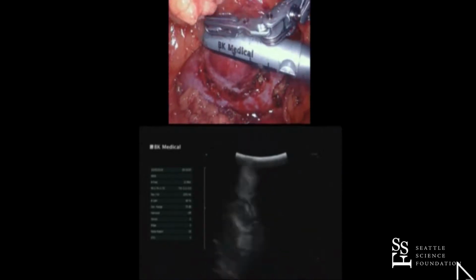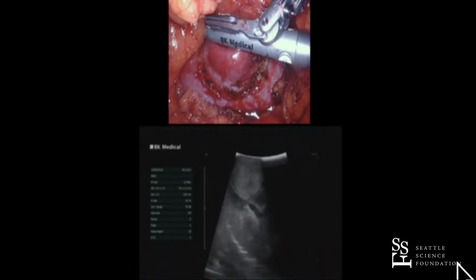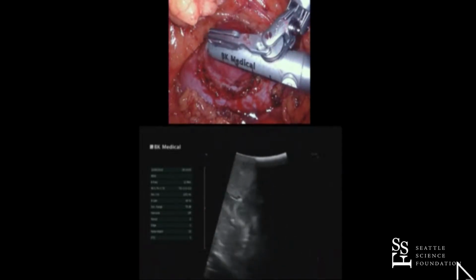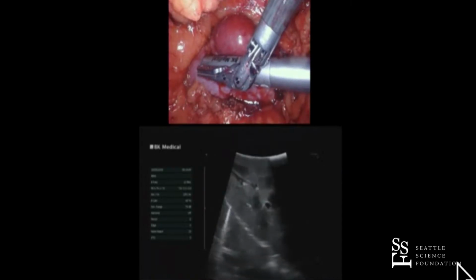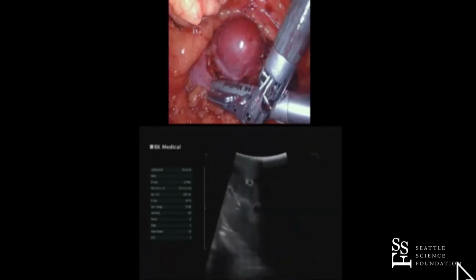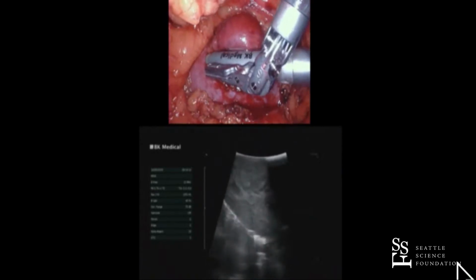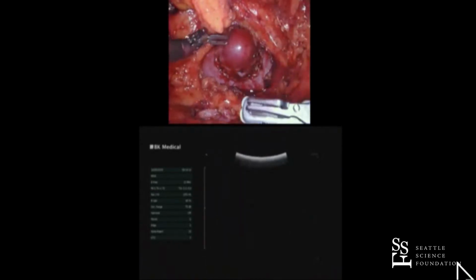So what I'm looking for now is just the depth. I've got it marked out, and it looks like it's medullary. It doesn't look like it goes very deep. So it looks like I want to get down about a scissor and a half depth all the way around and then come across the bottom. Okay, ultrasound out.